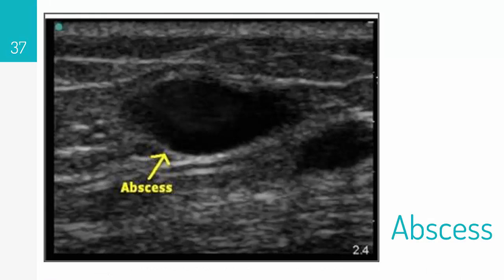In addition to identifying cellulitis, ultrasound is useful for finding abscesses, particularly occult abscesses in the setting of cellulitis, as we just discussed. As shown here, an abscess will appear as a hypoechoic black region on ultrasound. Ultrasound can also determine the optimal place for drainage to occur.